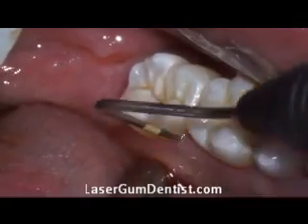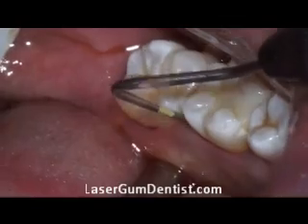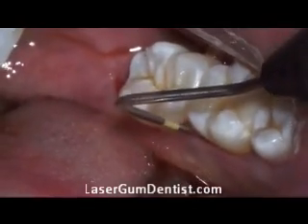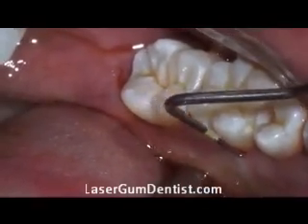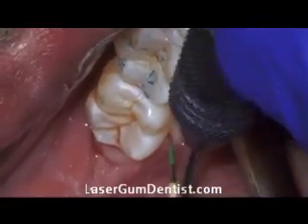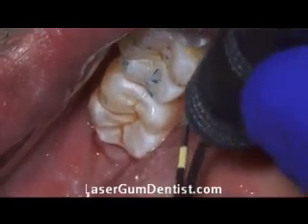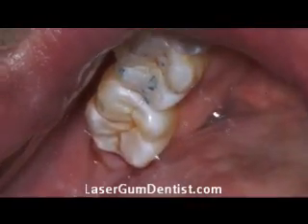If you look at what we're doing right now, we're placing a periodontal probe, which is actually a ruler that measures the distance or the space between the gum and the tooth. Healthy numbers are one, two, and three millimeters.